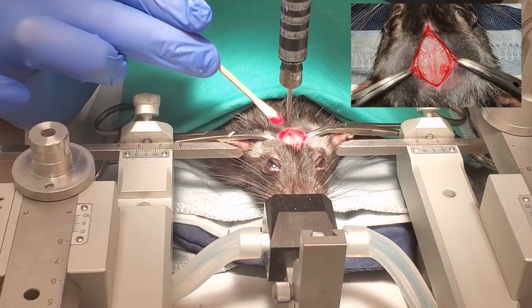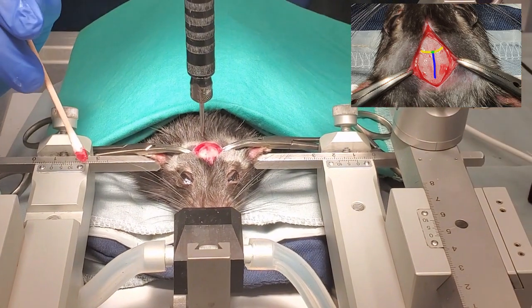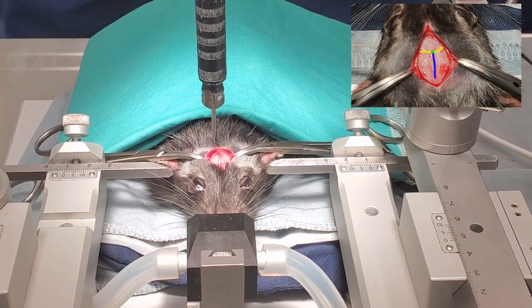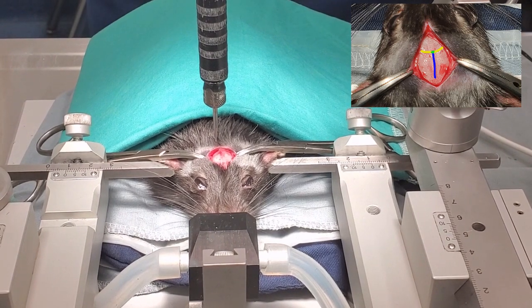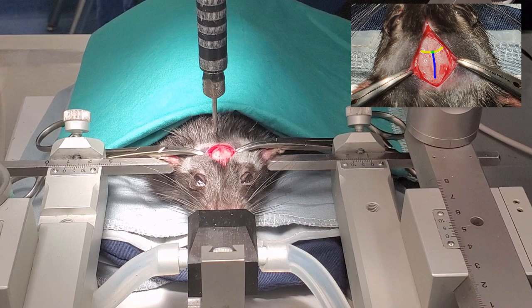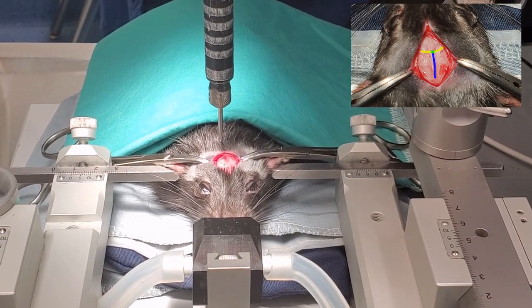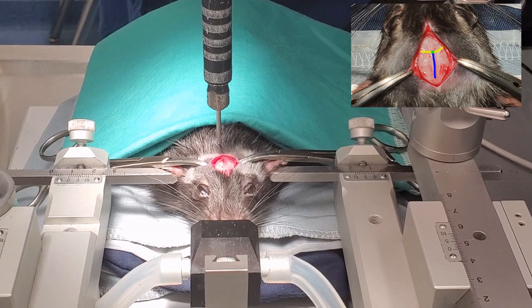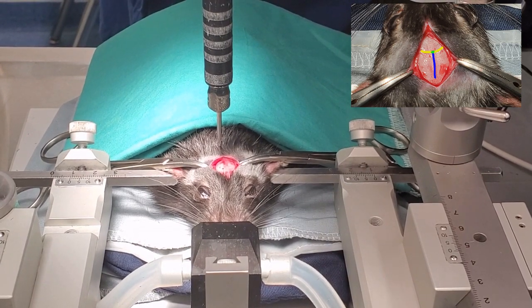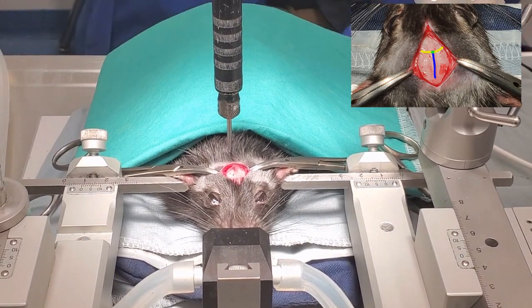On the skull of the rat, there are sutures where the skull plates fuse together. The point at the top, towards the rat's nose, where these sutures cross, is called bregma. Bregma is used as a landmark during stereotactic brain surgery. Using bregma, we can calculate exactly where to drill so that the tiny holes are drilled right above the hippocampus. The stereotactic arms allow us to be precise to within 1/10 of a millimeter.